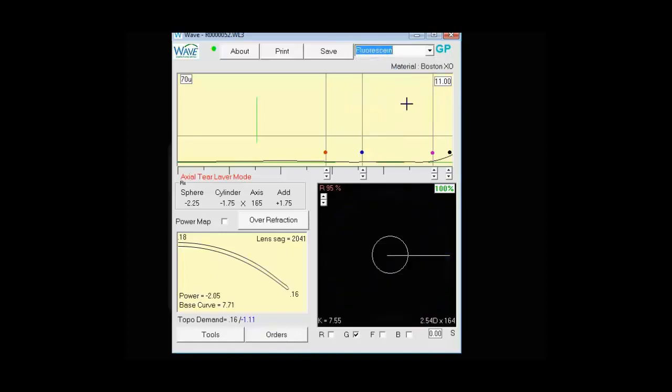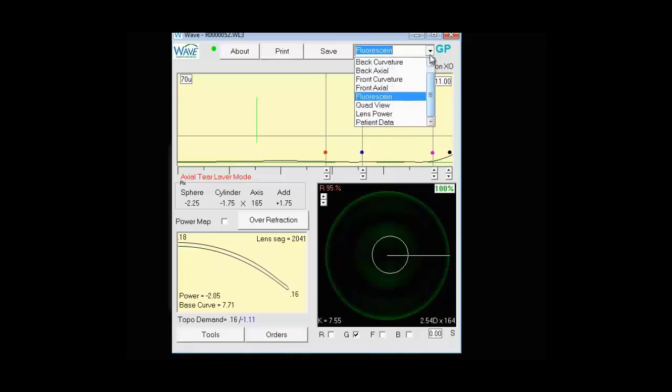If you want to see a larger fluorescein. And it's important to note on the larger fluorescein, you'll have control over how much fluorescein you'll be seeing under there. And back to quad view, and then there's lens power and patient data.